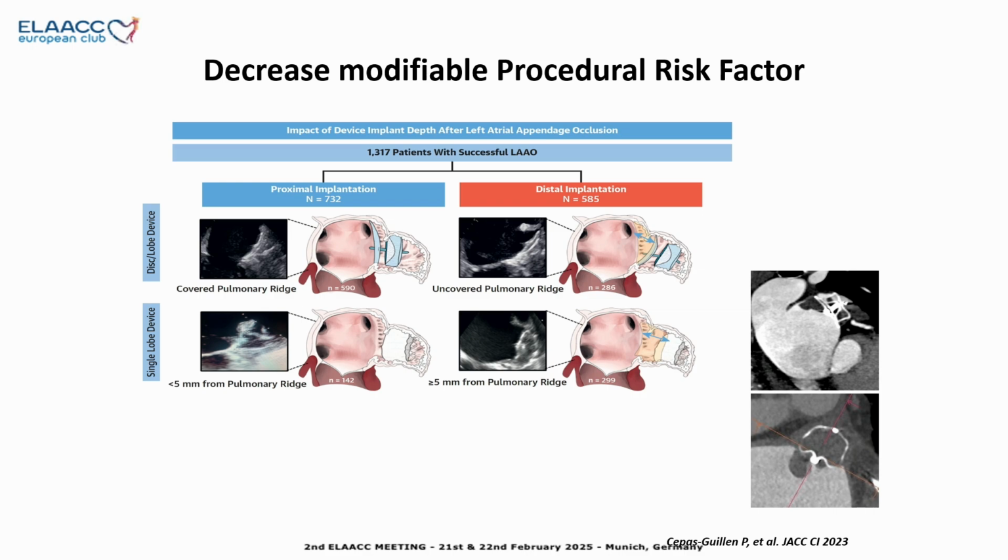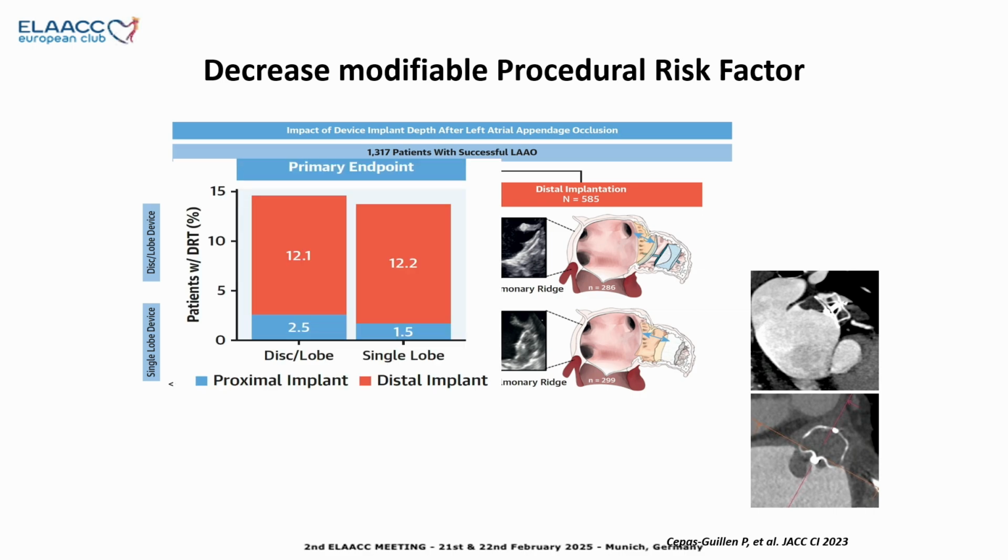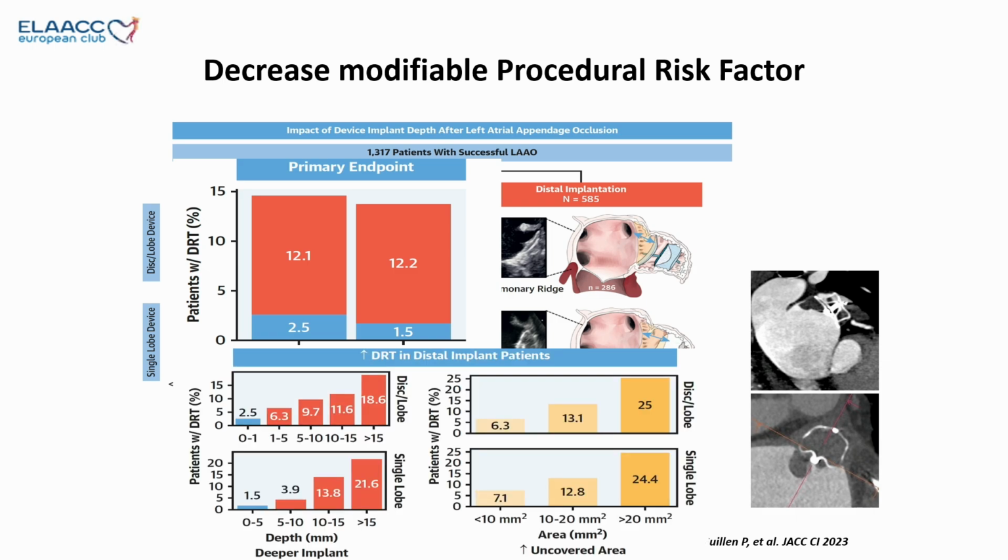But there are modifiable procedural risk factors, and deep implantation is for sure a modifiable procedural risk factor. Pedro Cepas and Xavi's group have very elegantly demonstrated these risk factors by showing that deep implantation is clearly related with a higher risk of DRT for pacifier and non-pacifier devices, and this risk is proportional to the uncovered area.